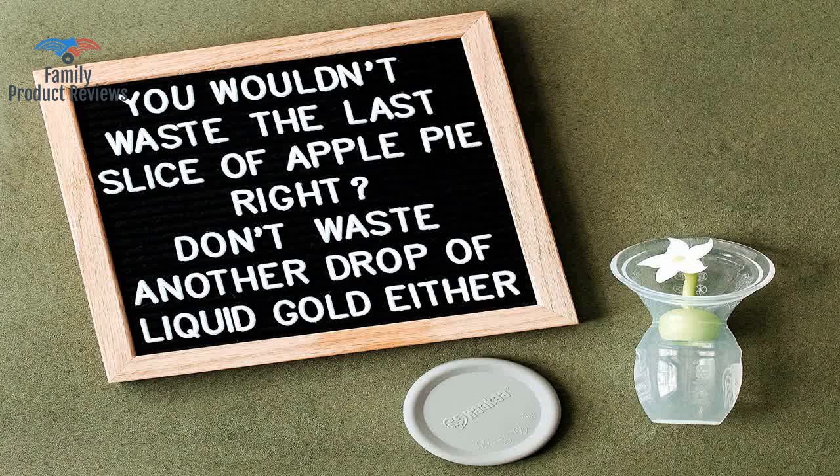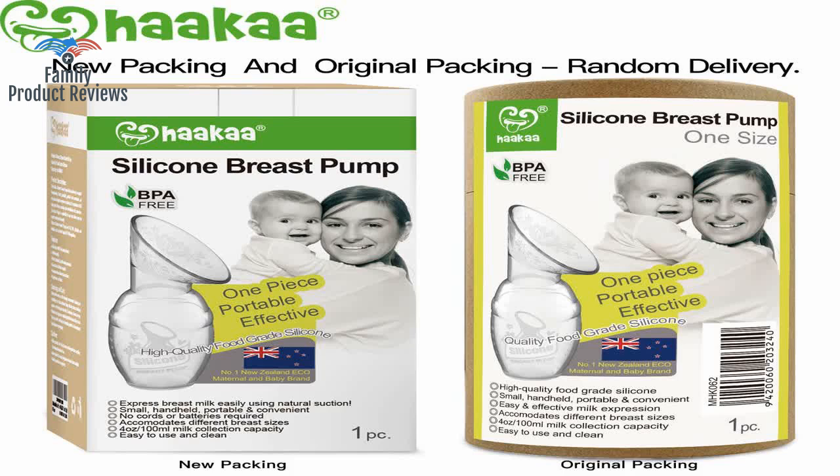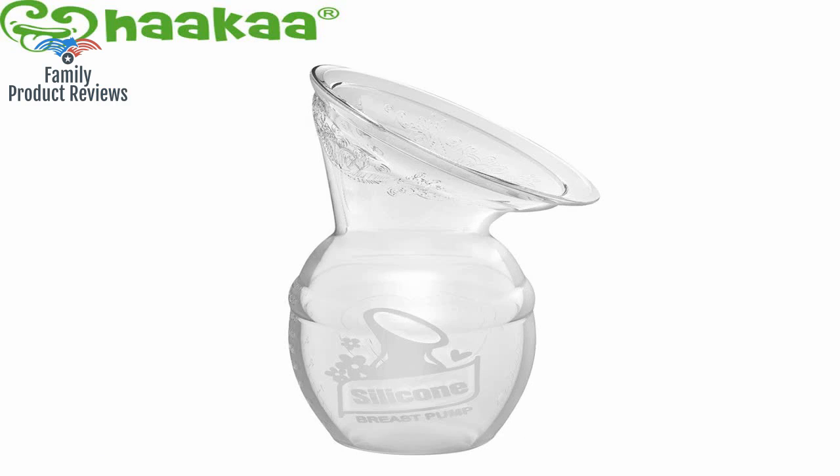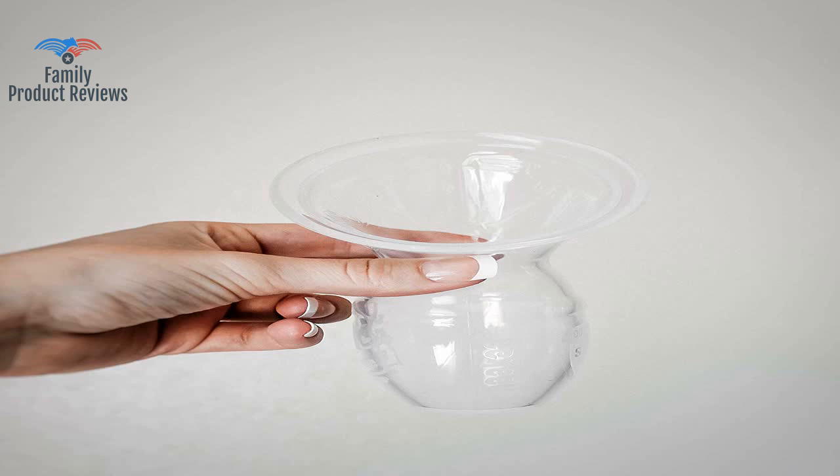It basically is able to catch extra milk while your baby feeds on the other side. If you're a first-time mom and already struggling to get breastfeeding down, it would be hard to manage having this as well. It holds well to allow use on one side while you nurse on the other, and has been a lifesaver during overnight feeds when the little one falls asleep after nursing on one breast.